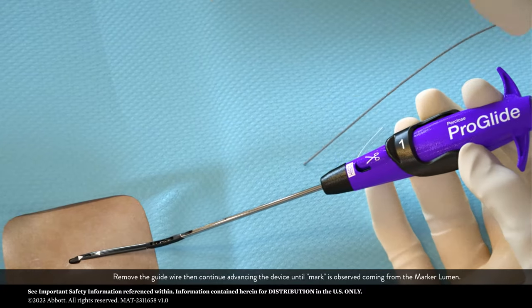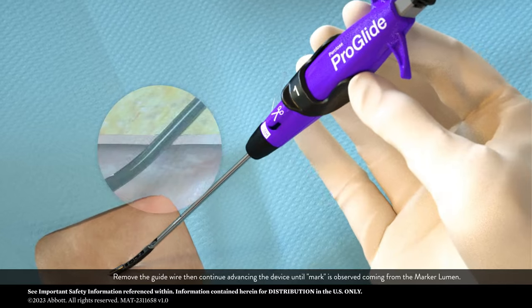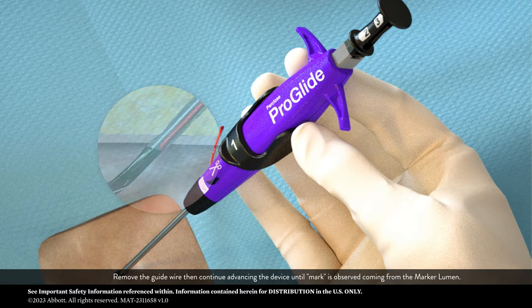Remove the guide wire, then continue advancing the device until mark is observed coming from the marker lumen.